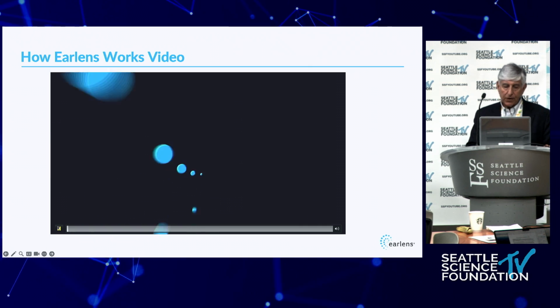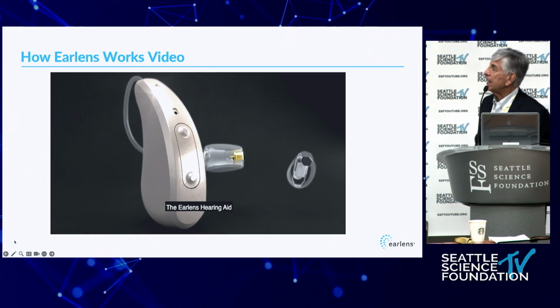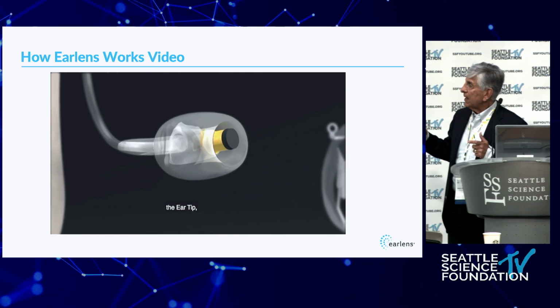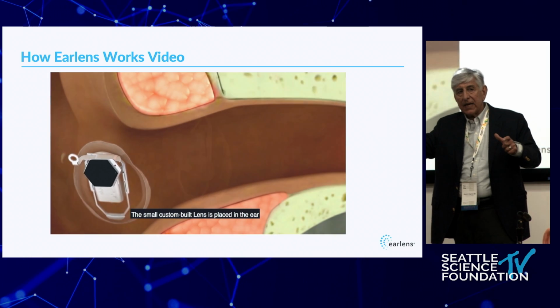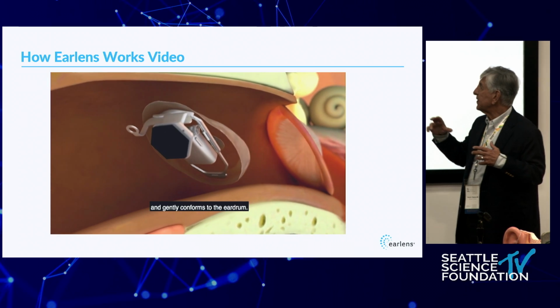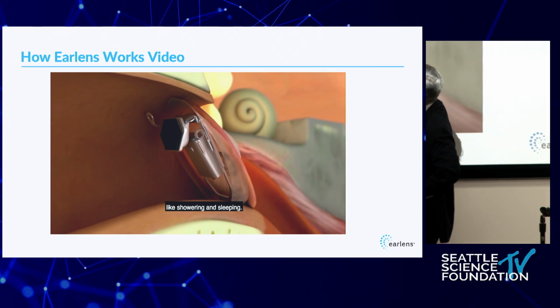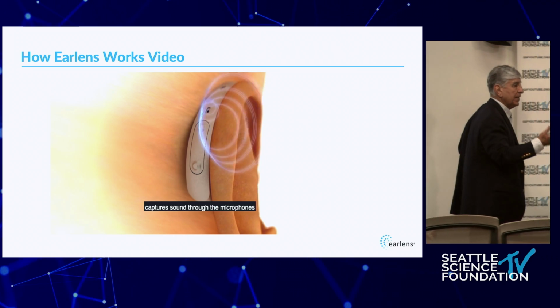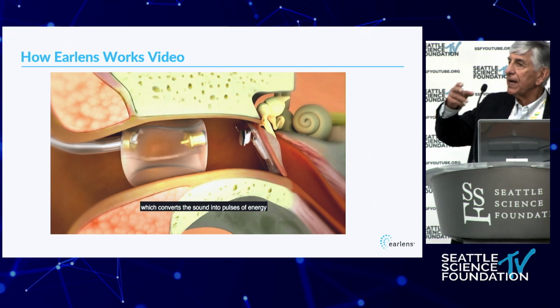It's an advertisement, so you're going to see some advertisement kinds of things, but it's kind of a cool device. It's an electromagnetic device. The tip of the Earlens is a little bit like sending a magnetic signal. Traditional hearing aids send an acoustic signal, but this is a magnetic signal, and the lens fits on the ear canal with a little plunger that touches up against the eardrum. Then it is electromagnetically stimulated, and it causes vibrations of the tympanic membrane.